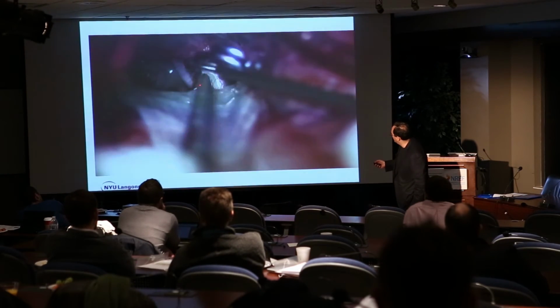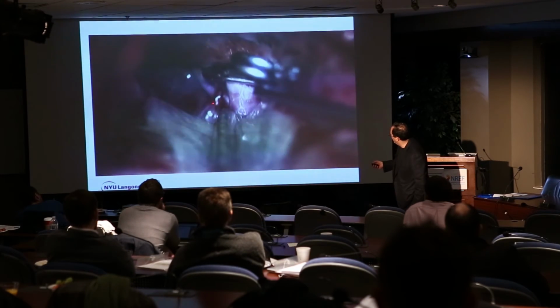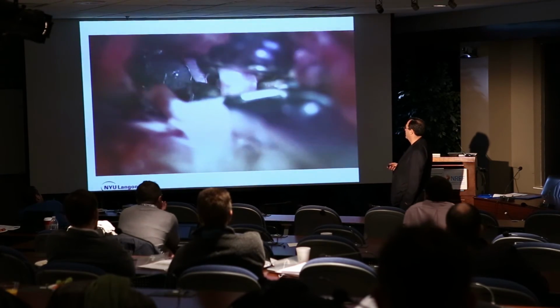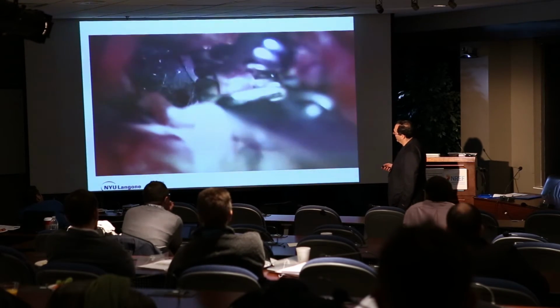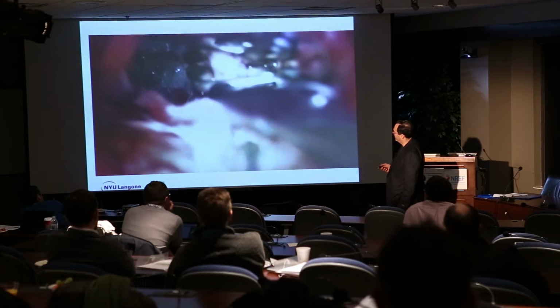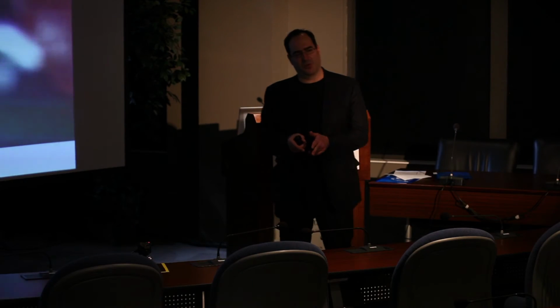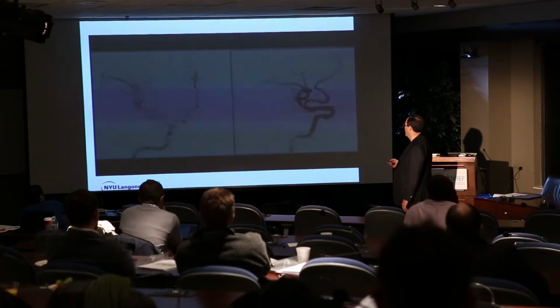You see the aneurysm is still right here, proximal to it, okay? And you can't see it so well, but there's some perforators deep to that. So you want to be careful. You see the perforators coming out. You want to be careful not to get those in the clip. And here's the second fenestrated clip that closes down the entire aneurysm, and then we'll take off that other clip. But the technique of stacking clips or using a clip as a space holder is very useful. You can see the aneurysm is gone.